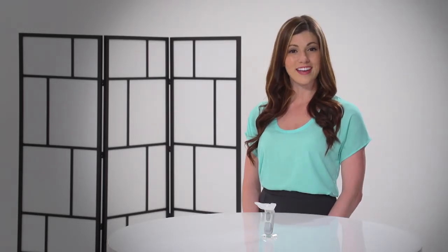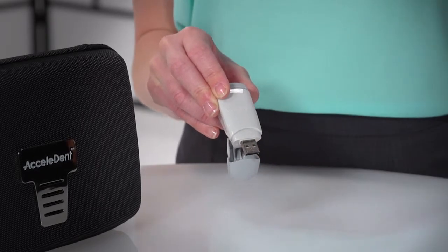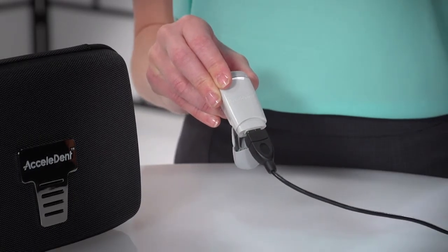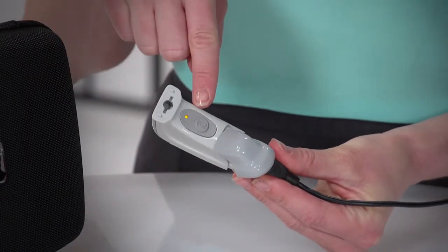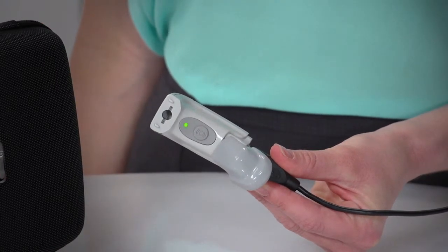Prior to first use, fully charge your Excelident Aura overnight. For subsequent charging, allow 2 hours for the battery to reach full charge. The activator is properly charging when it is attached to the power adapter and plugged into a powered electrical outlet. When charging, the LED indicator will slowly flash orange, and when it reaches full charge, the LED indicator will be solid green.